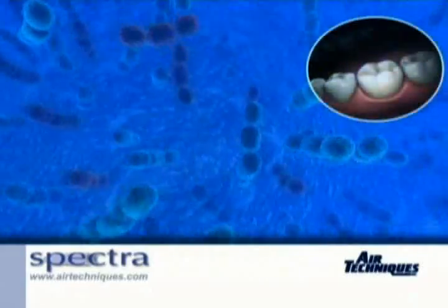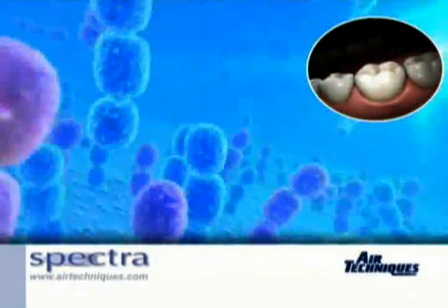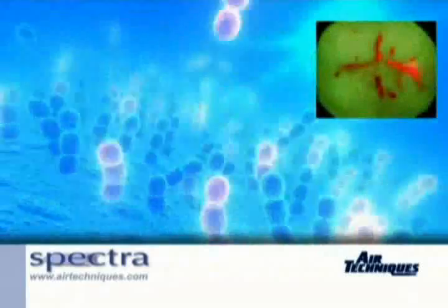As the high-energy blue-violet light from the LED passes over the tooth structure, healthy enamel will fluoresce green, while special metabolites of cariogenic bacteria called porphyrins will fluoresce red.